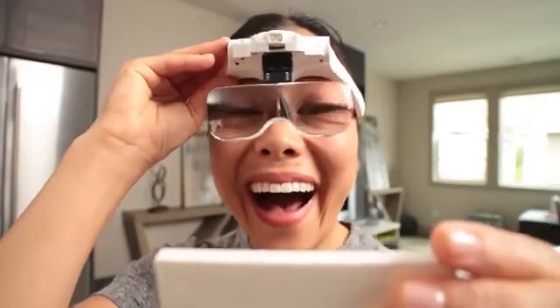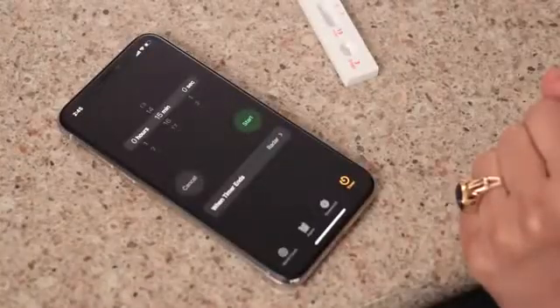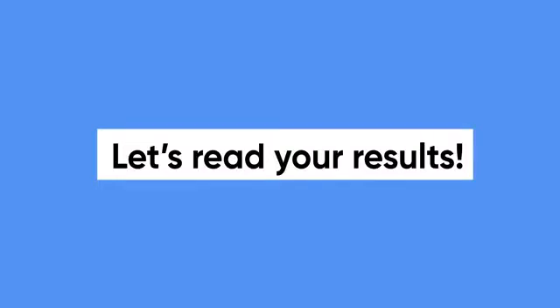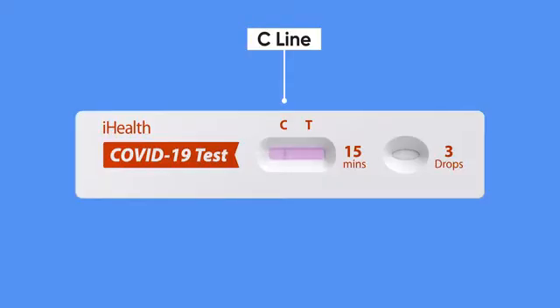After 15 minutes, you can officially read the results of your test. But be aware, you only have another 15 minutes to read them before the results are officially considered invalid. It's a good idea to set another timer. Let's read your results. The C line is the control line. A line should always appear under the C. This tells you that the sample has been absorbed into the strip and that the test card is valid.